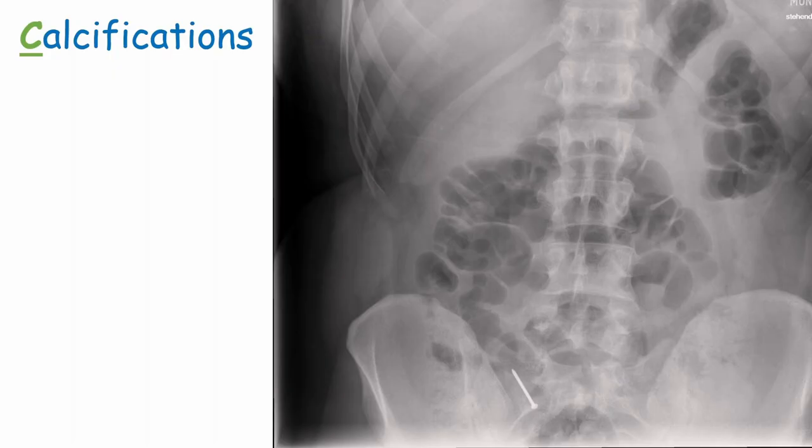A patient who swallowed a nail had it pass through the GI tract without causing any perforation. At that point in its journey, the nail was in the distal ileum, just before the cecum. This patient didn't require any surgical intervention - the nail passed naturally.